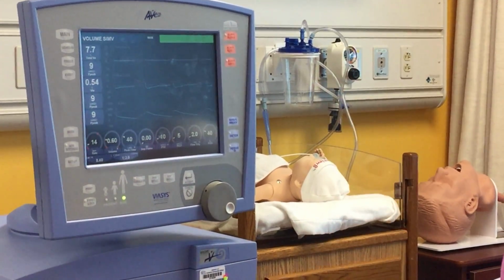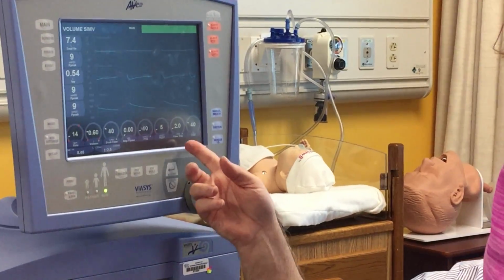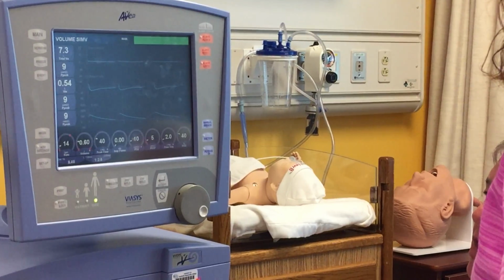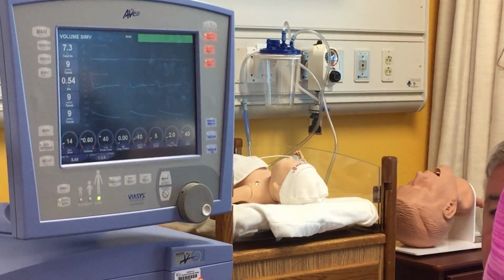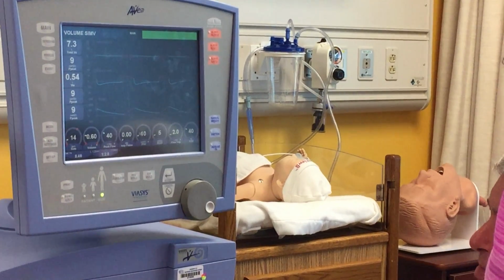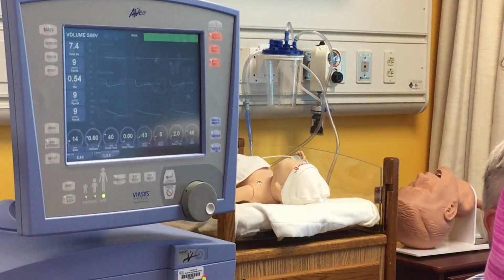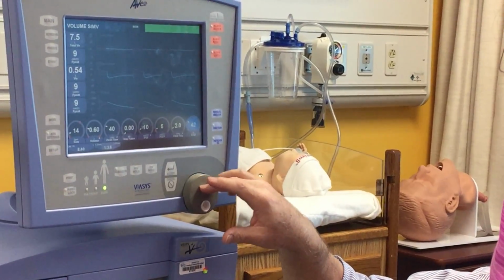PEEP, positive end-expiratory pressure, we talked about that today. Helps me, keeps the alveoli open. This is our flow trigger. We talked about flow trigger, didn't we? Okay. 1 to 2 is usually a pretty good setting to go. But make it less than that, it, pardon me, becomes too sensitive. Anything more than that, it's hard for the patient to trigger the ventilator. Okay? And then this is our FiO2. So I think we have that at 45 on the board.